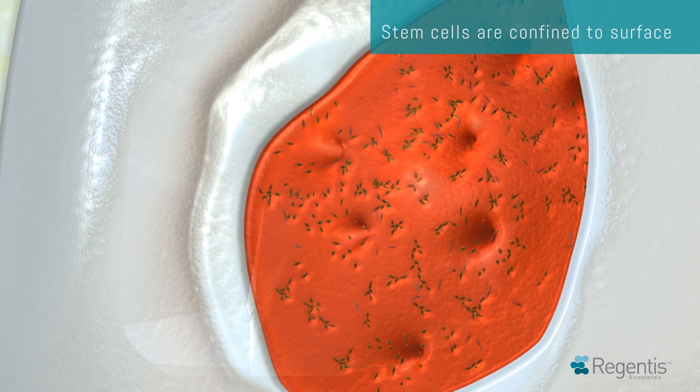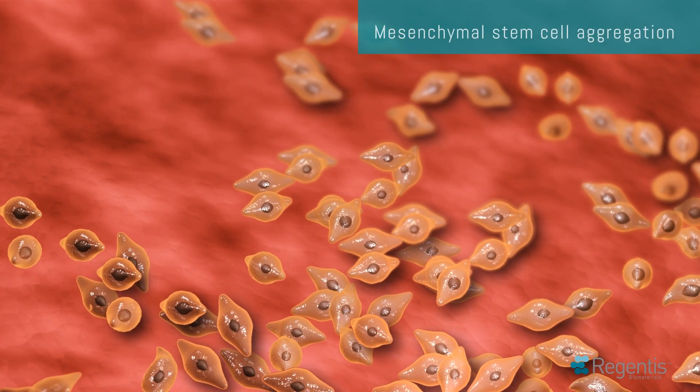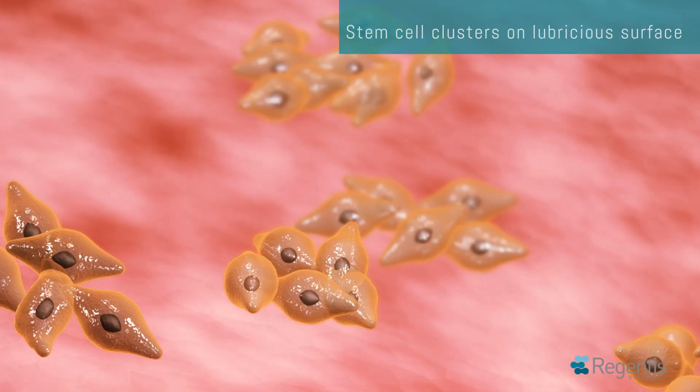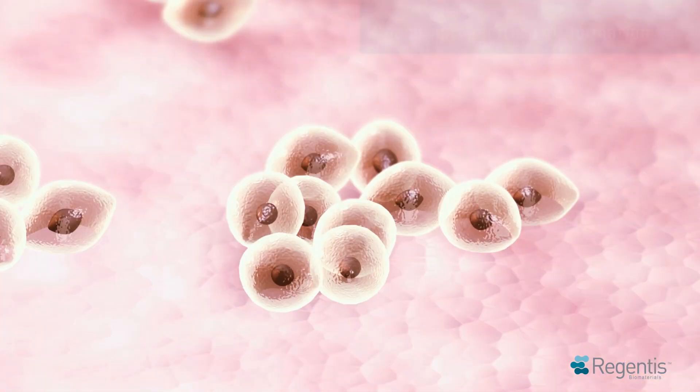The lubricious, weakly adhesive surface of Gelrin-C drives stem cells to aggregate on its surface, forming stem cell clusters. Mesenchymal stem cell aggregation is a critical step for chondrocyte differentiation.